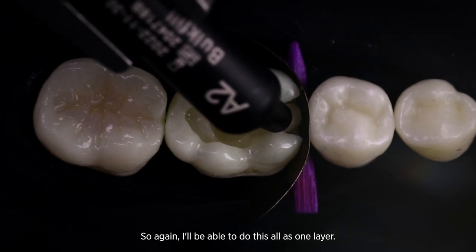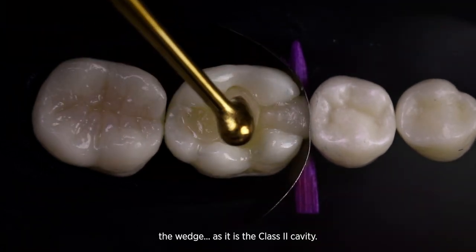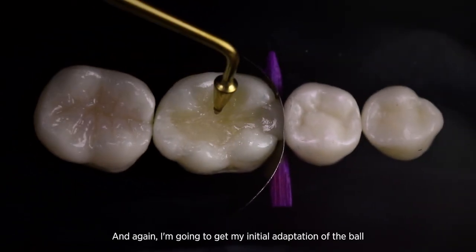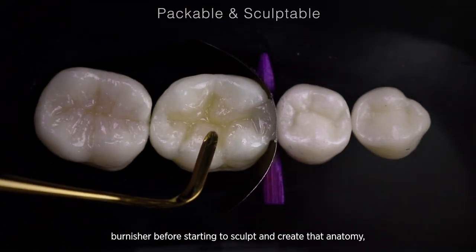Again, I'll be able to do this all as one layer. I'm just using a simple sectional matrix here with a wedge, as it is a Class II cavity. Again, I'm going to get my initial adaptation with a ball burnisher before starting to sculpt and create that anatomy.